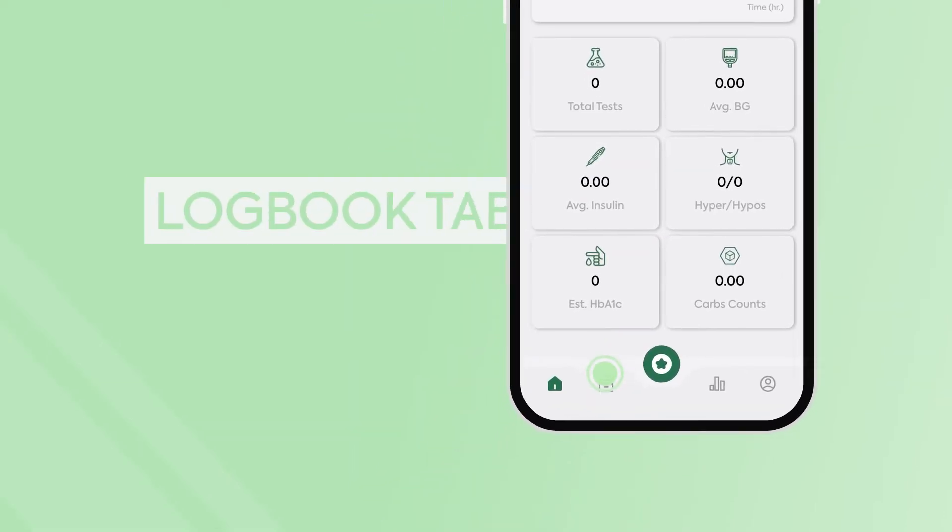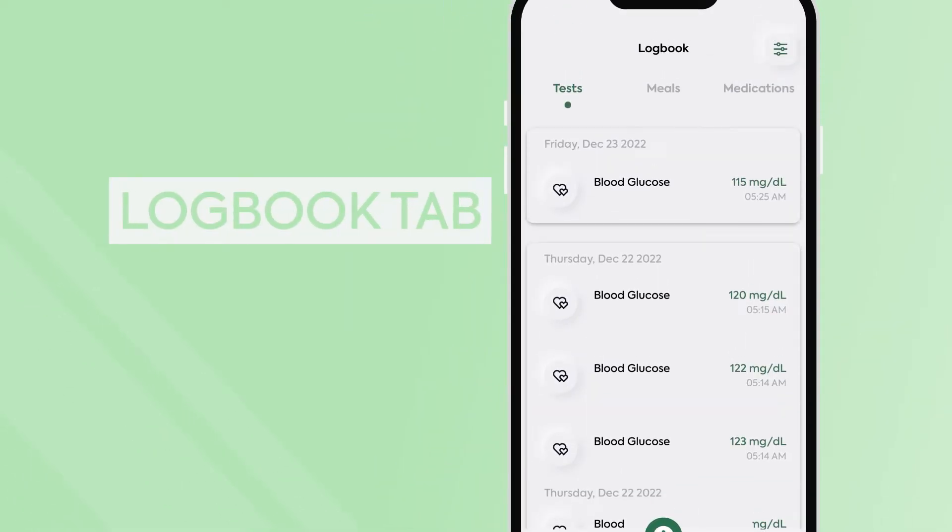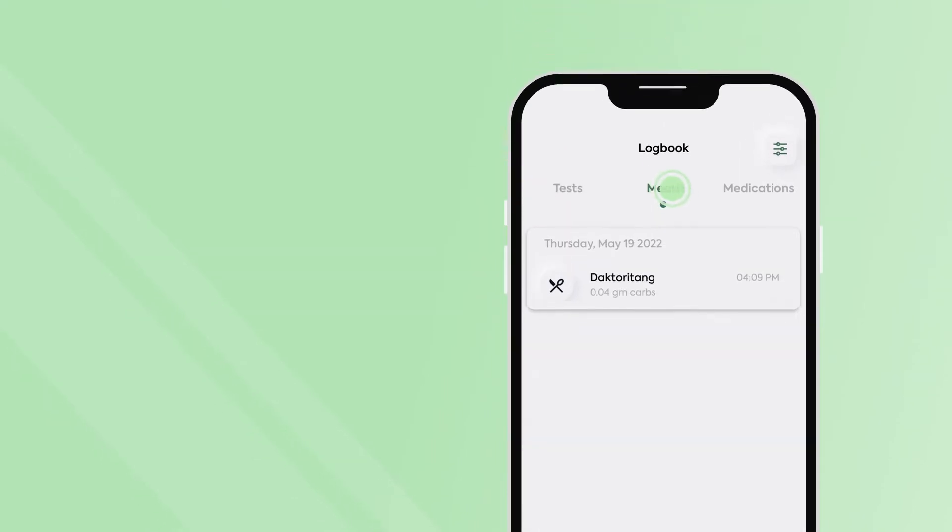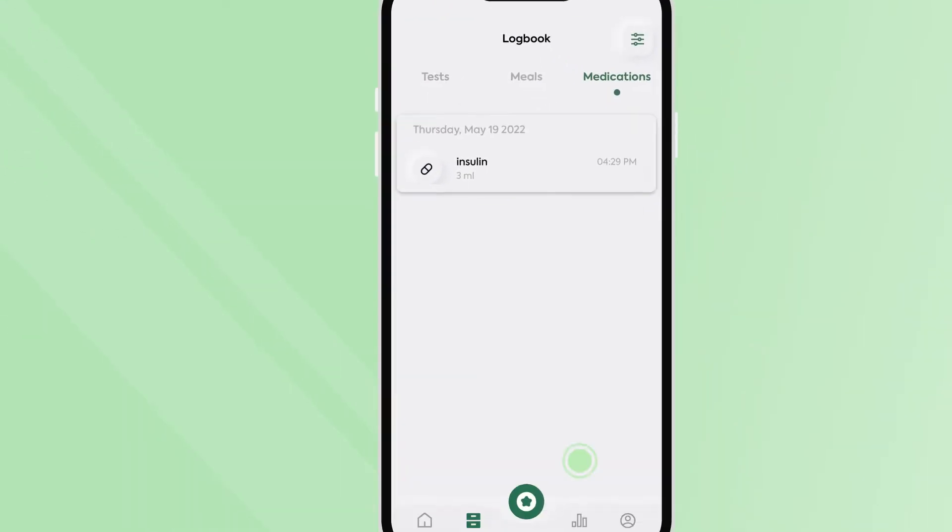If you click the Logbook tab, you will be able to see your past test results as well as meals and medications that you've logged.